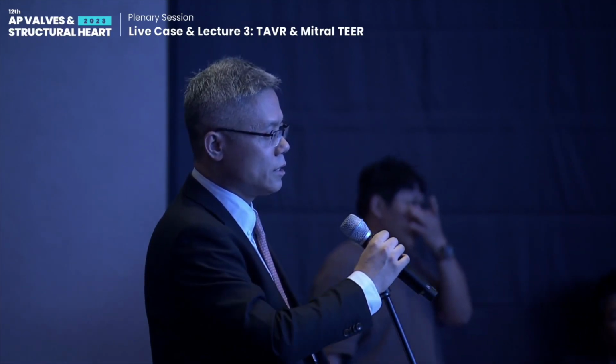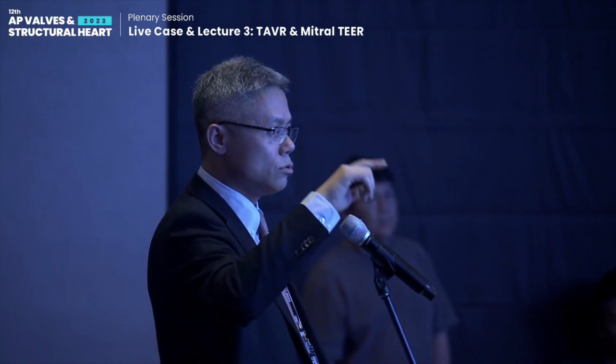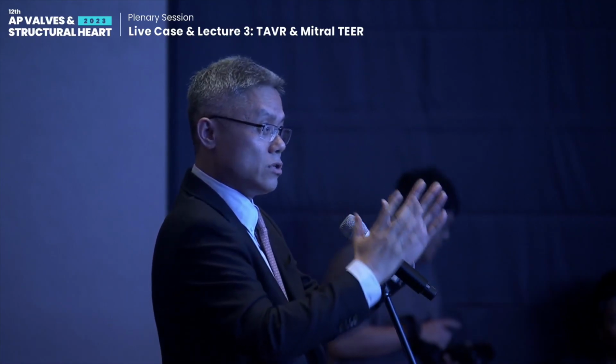So far, I think CT analysis is very, very important for patient selection. The biggest annulus size is 85 millimeters so far for VitaFlow. Under this, I think the oversize ratio may be 1.1, something like that. Another important parameter is the LVOT diameter. The ratio between the LVOT diameter and the annulus should be between 0.95 and 1.05.